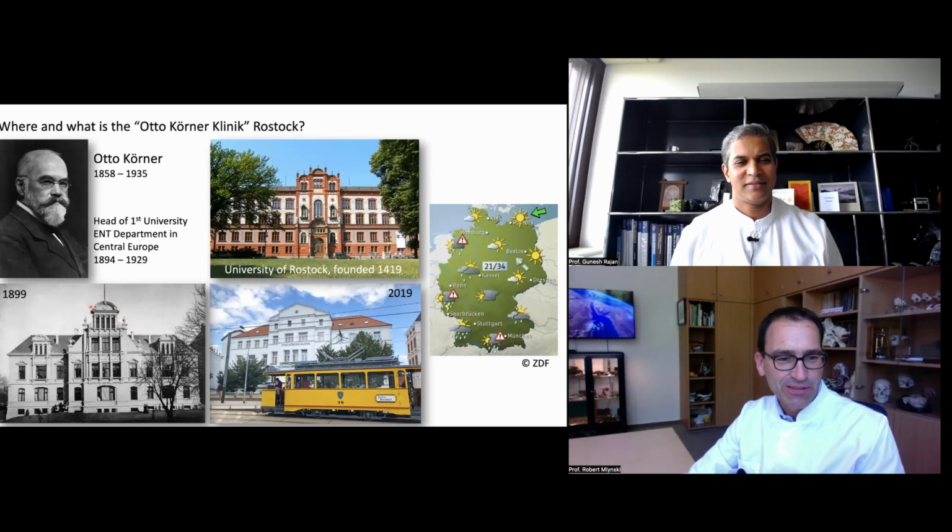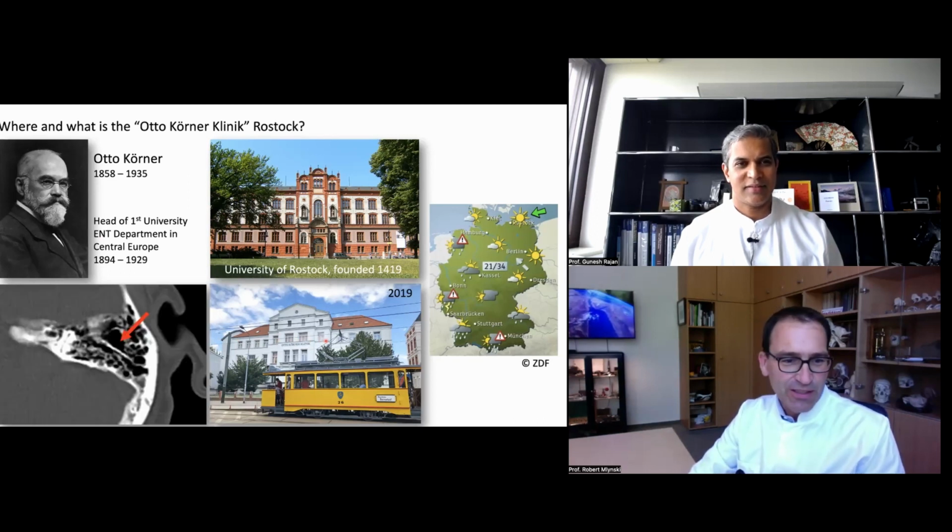This is the hospital. He was awarded in 1899. It's the same hospital we're still working in. And most of you know Otto Körner because of the Körnersches septum, ossified petrosquamous suture. But let's do some cochlear implant surgery.